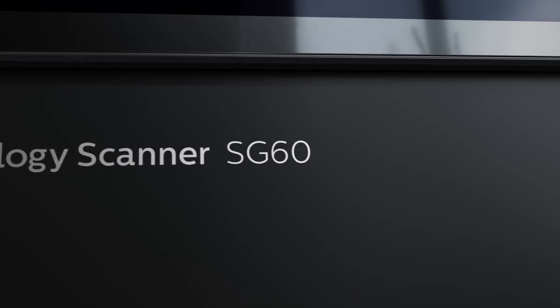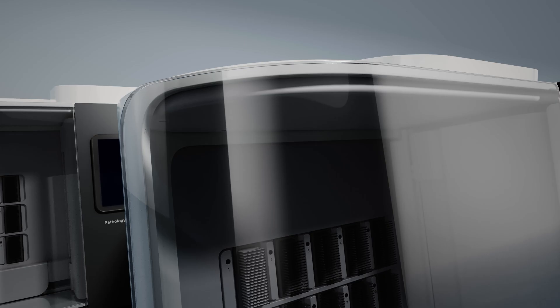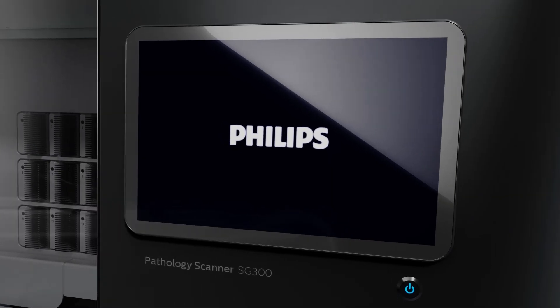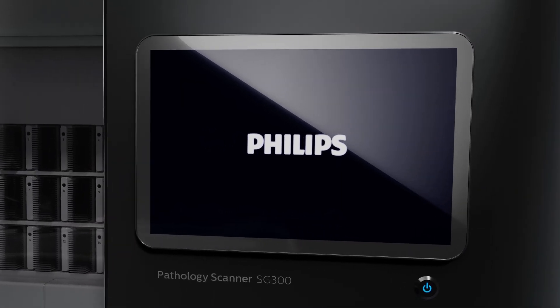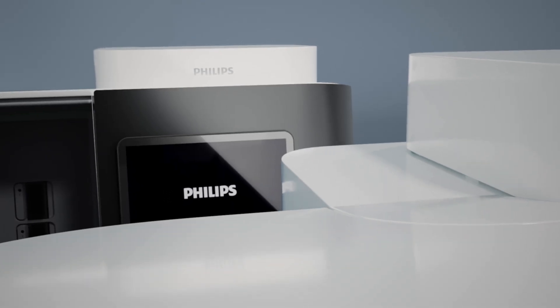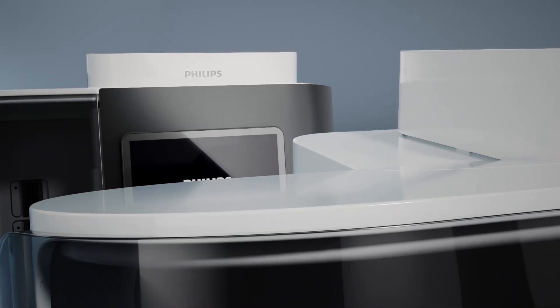The faster you can turn glass slides into superb quality images, the sooner they can be used to guide treatment and empower clinicians to make informed patient care decisions. Philips Pathology Scanner SG family are an integral component of Philips IntelliSight Pathology solution, an innovation designed to change the way you do pathology.